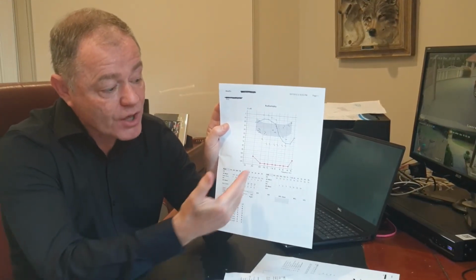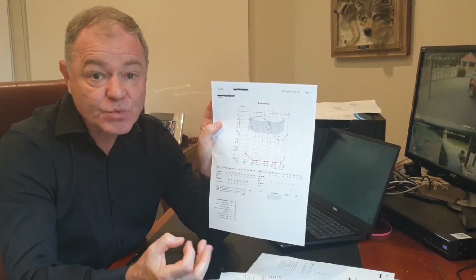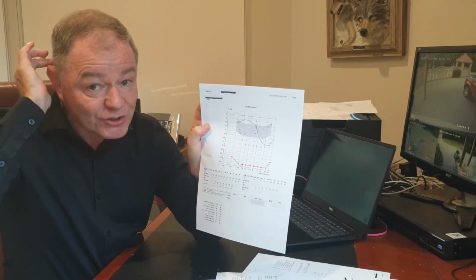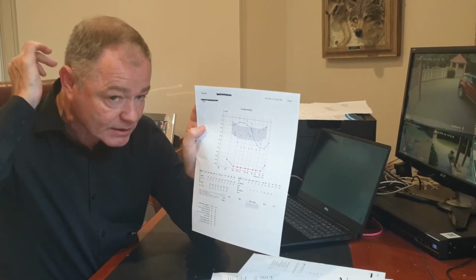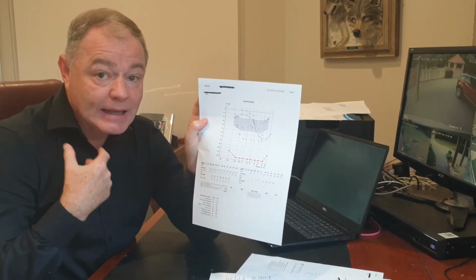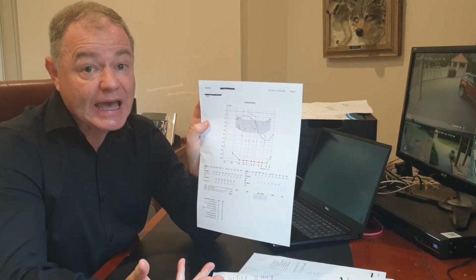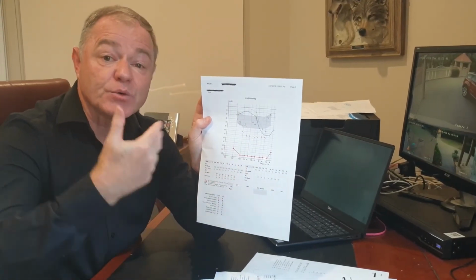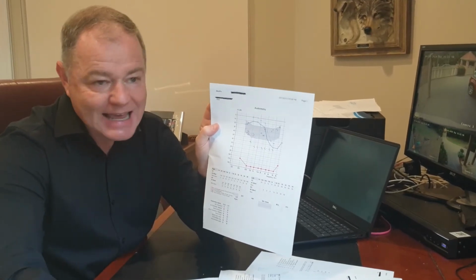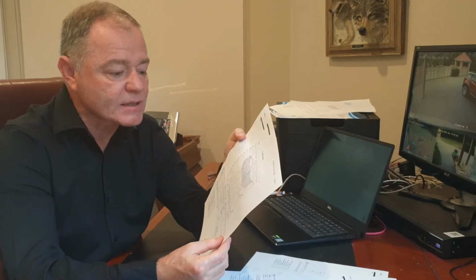And then these days, your other option with a loss like that would be a cochlear implant. This is where you'll actually have a device basically drilled into your skull with a little electrode. You'll still wear a hearing aid behind the ear, but it enables people with no hearing whatsoever to be able to hear again. So in that situation, again, you'd be referred to your ear, nose and throat specialist, who would then assess your suitability for that type of process.